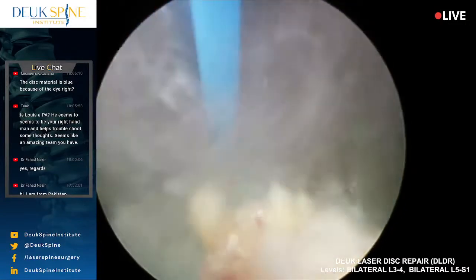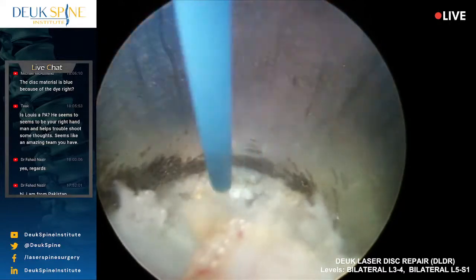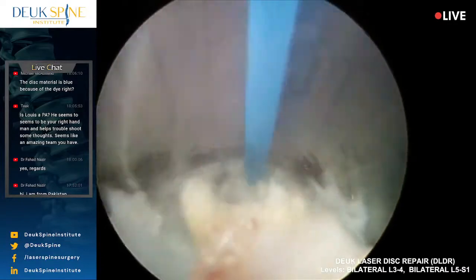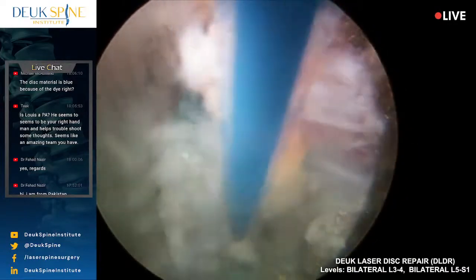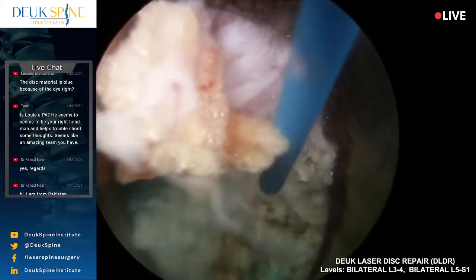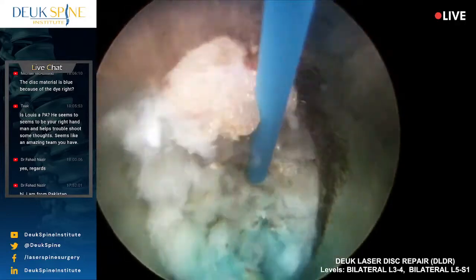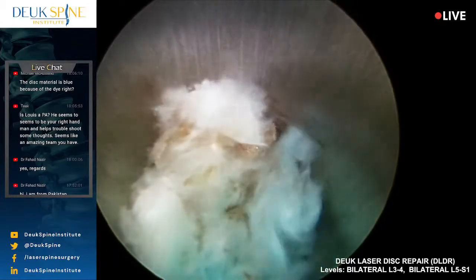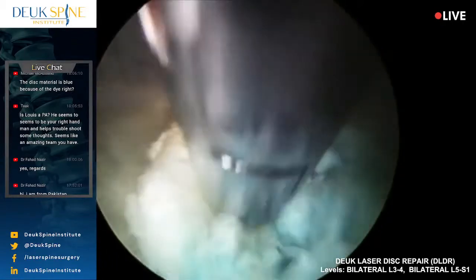How's our irrigation doing? We're going to get into that after this, because we've got one more disc to do. Grab her. So much herniation.